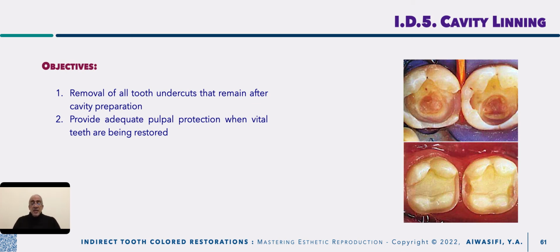But here, as it is luted or cemented with adhesive resin cement, you could reinforce it, and to let your cavity be much more conservative, any undercuts that will not severely undermine your enamel could be blocked with any compatible resin material, to ensure proper bonding between it and the luting cement and then the fitting surface of your inlay.